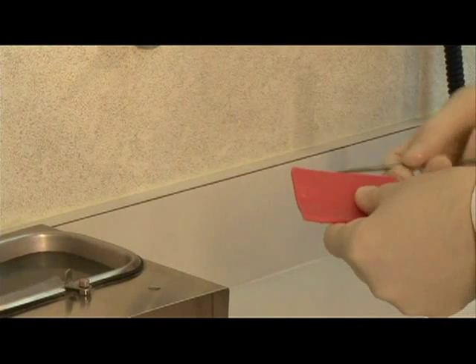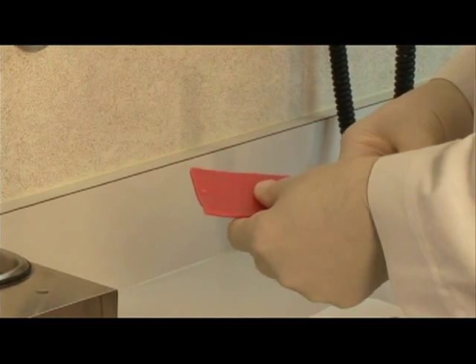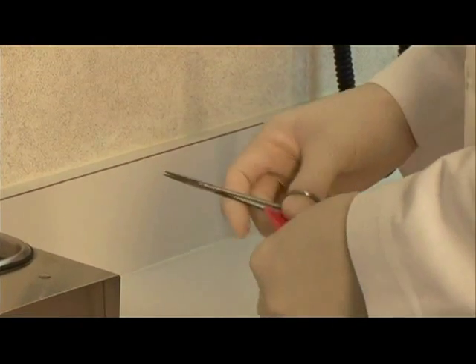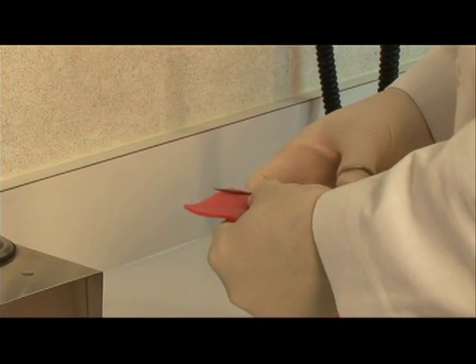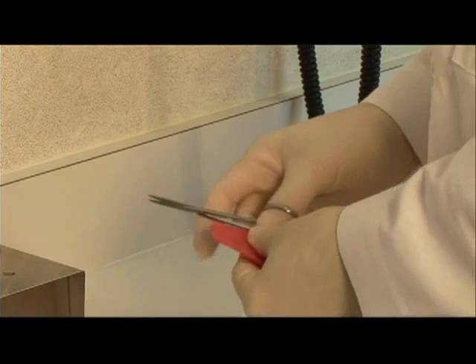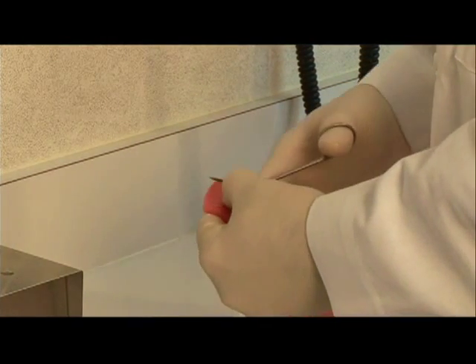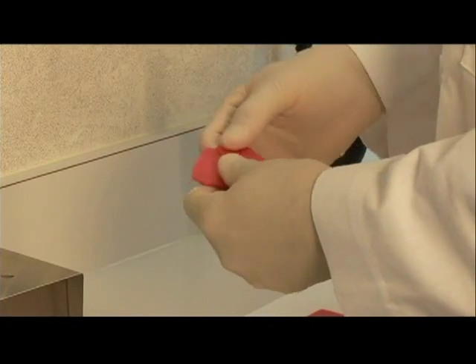We first soften the wax, then fold it on its end, and then cut it to the approximate size of the dental arch. We want to cut it in somewhat of the shape of the arch as well, and we will also allow room for the leaf gauge or any anterior deprogrammer to be able to be used in this step. Again, the anterior area is relieved.